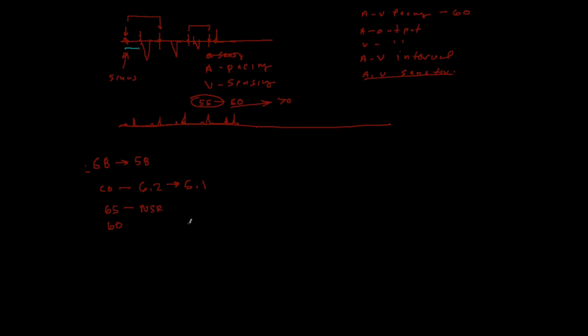And so you're taking a look at what's going on, and what you see is basically A pacing and V pacing. And your pacer is set once again at a rate of 60, and the PR interval that you have set is 180 milliseconds. So the question is, what do you do? You're watching this patient chug along, being completely AV paced every second with a lower cardiac output, lower blood pressure.